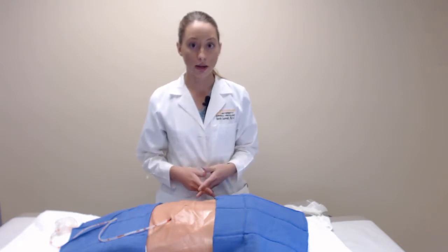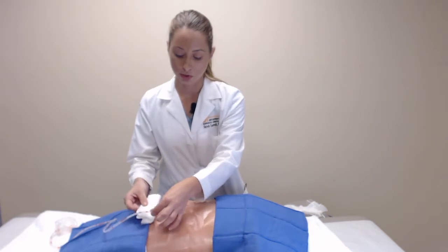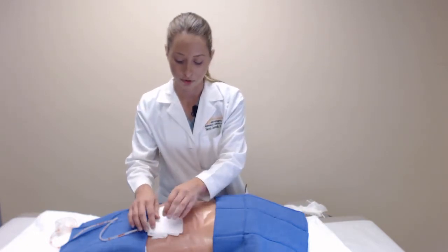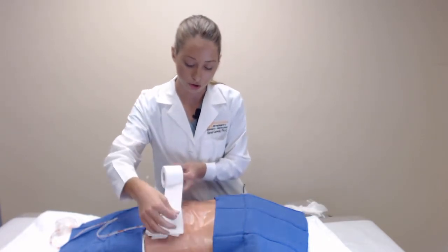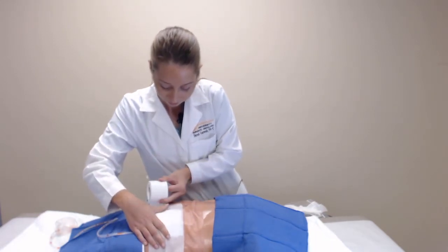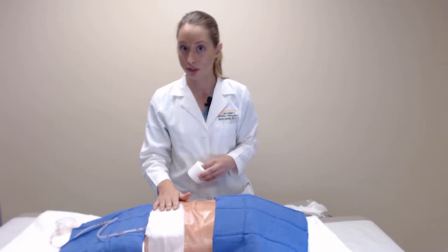Once your drain site is clean, it's then time to dress your drain. To dress your drain, you'll take 2 pieces of 4x4 gauze and fold them in half. You'll place this between your skin and the drain tubing. Once that's in place, you'll take 2 more pieces of 4x4 gauze and place that on top of the drain exit site and the tubing. To secure this dressing, you'll use Me-Fix tape and secure it like so. It is important to note that if you're going to dress your drain as shown, to change this dressing every day regardless of if you shower.